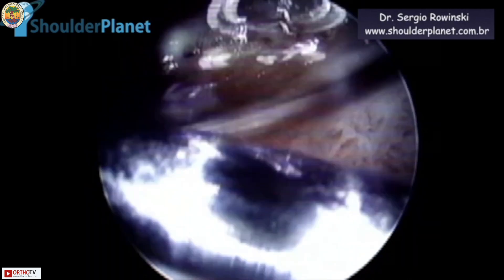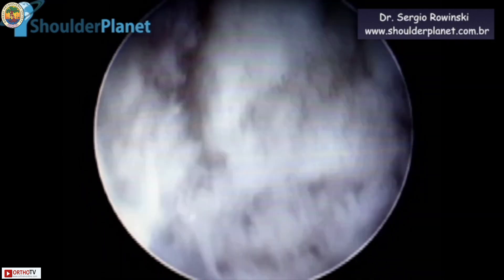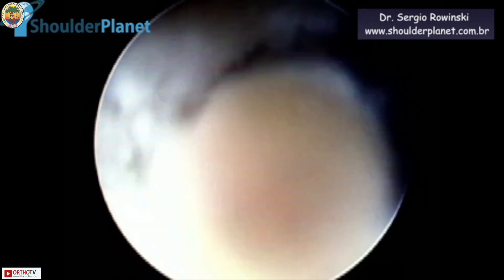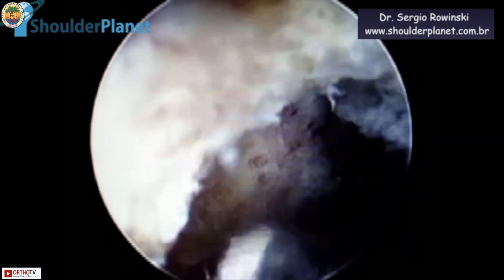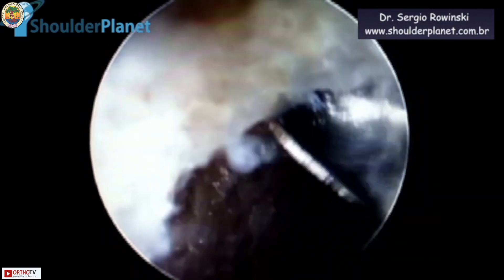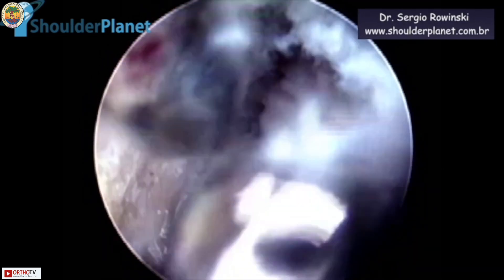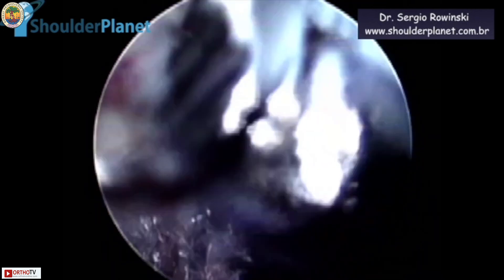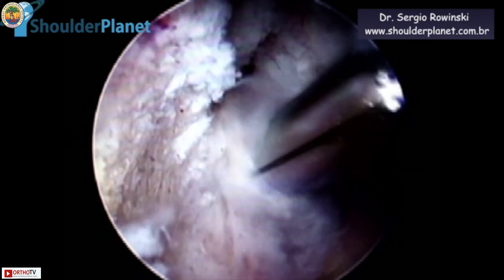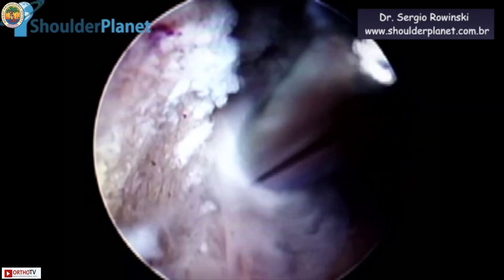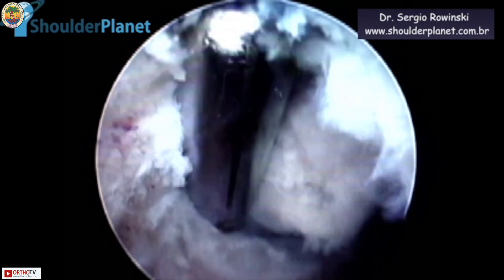Now we are entering the very posterior part of the AC joint. The acromion is on the right side and the distal clavicle is on the left side. This is the best way, in my opinion, to achieve the very superior parts of the remaining bone in the distal clavicle. Now we are working through the anterior portal, removing all the bone left in the anterior superior part of the distal clavicle. We then use a soft shaver to get a very clear view and remove the AC joint capsule. We are measuring the interval already created — about four to five millimeters.